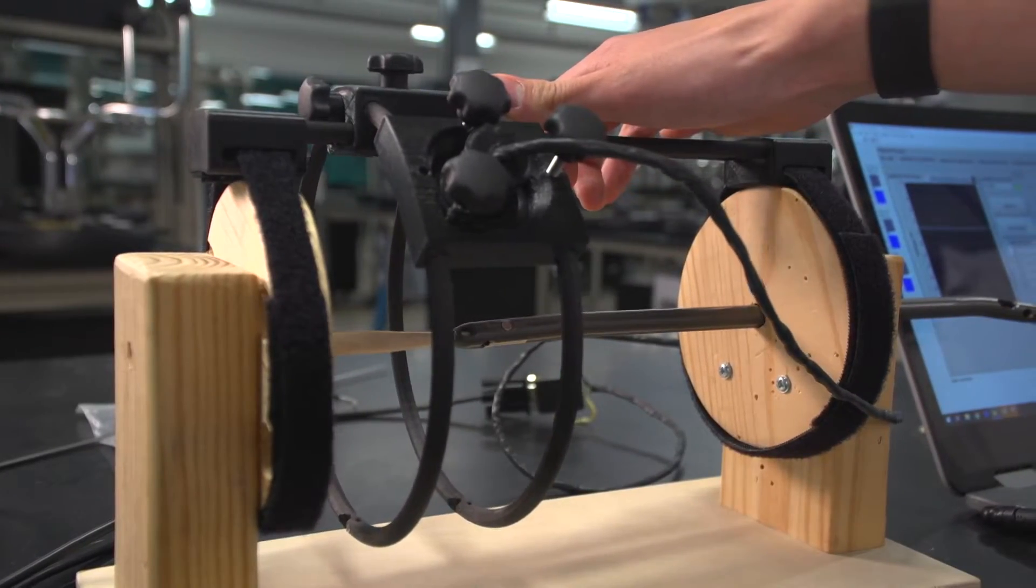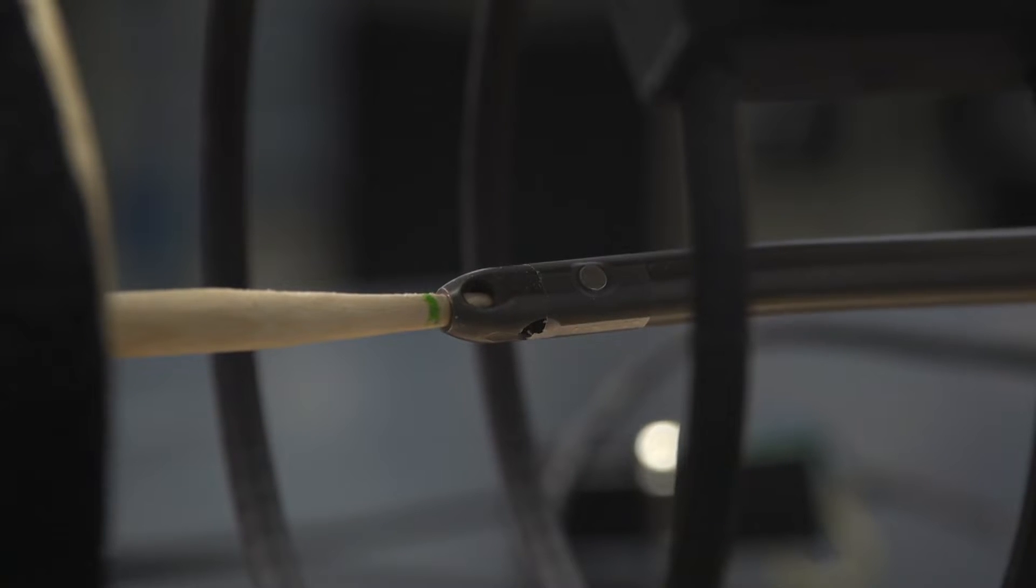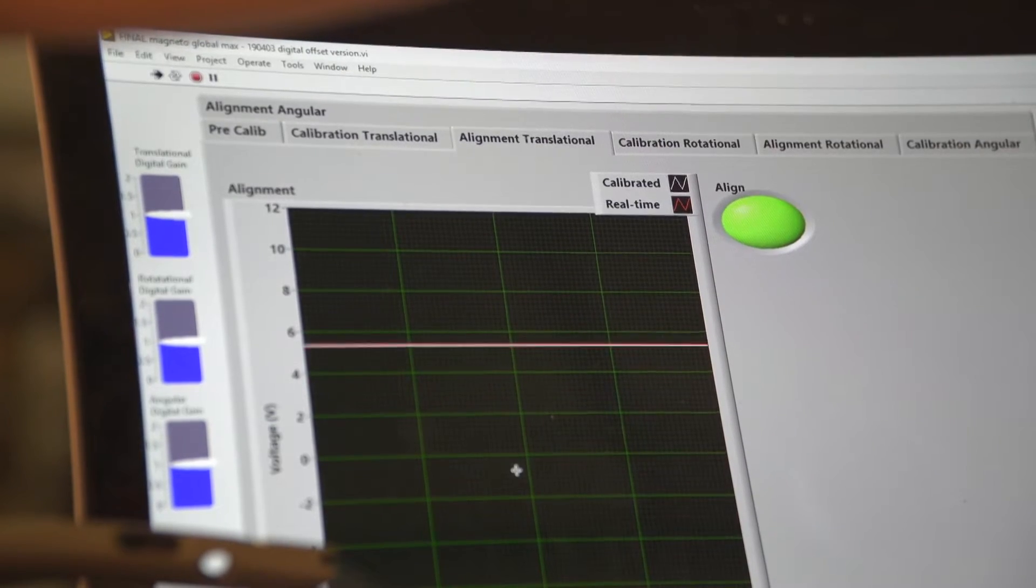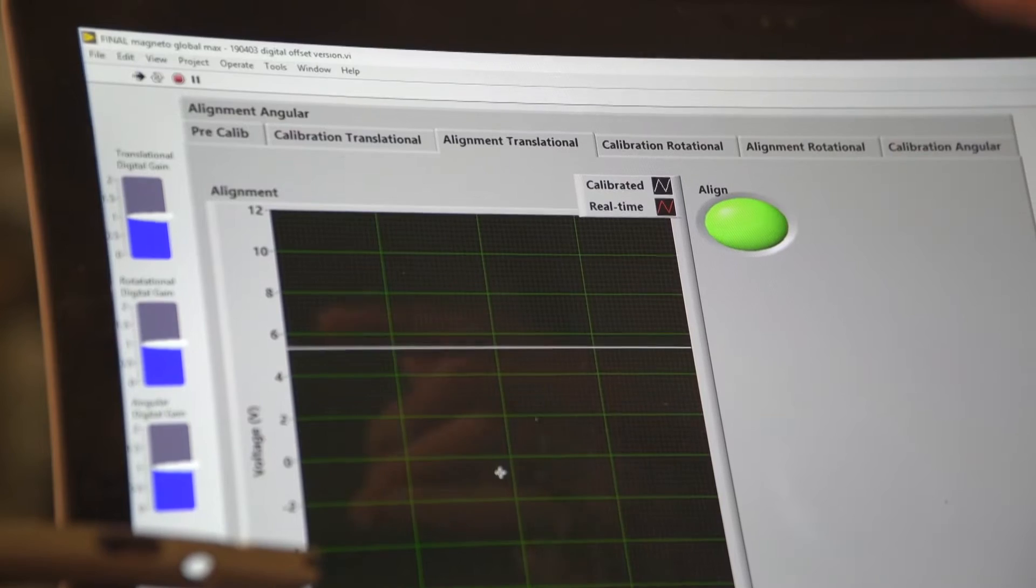The students invented a device that locates the hole in the rod by detecting magnetic fields. Once that light lights up, we know that it's aligned.